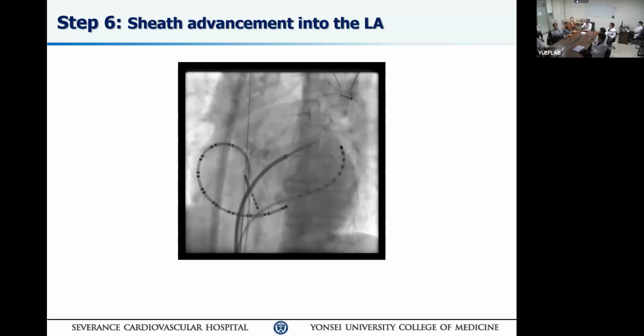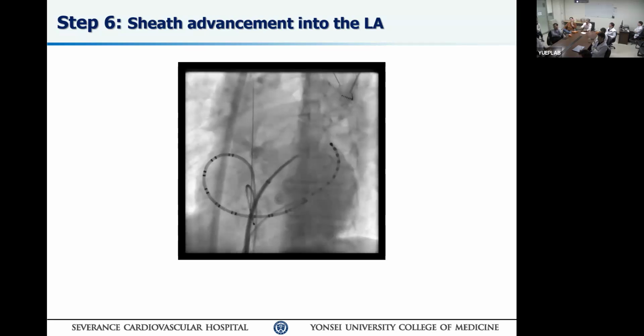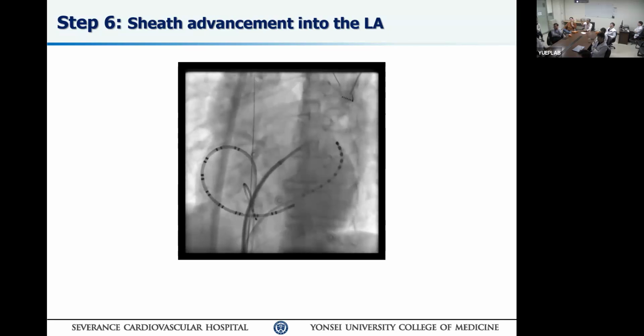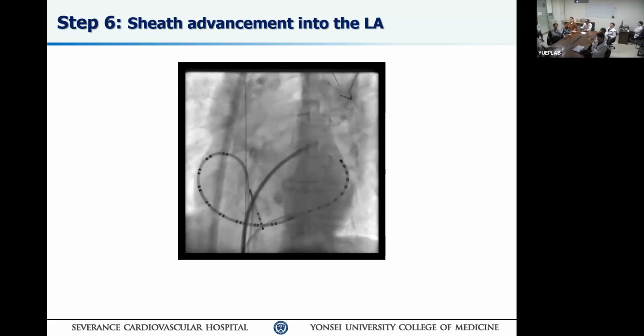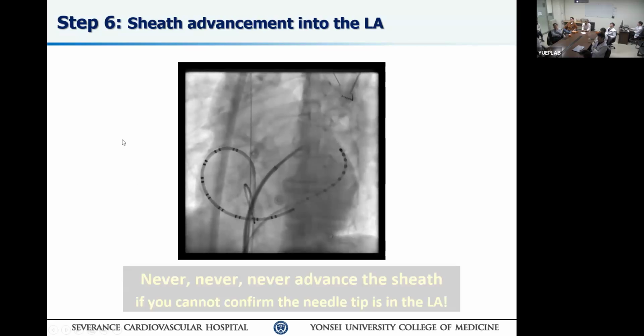Invariably, blood will not come out. You're in the wrong space. So do not. Important to watch that at the end of the sheath coming off, the sheath rise, you're almost sure you're in the cavity. Okay? All right. It's a minor detail that is often missed.